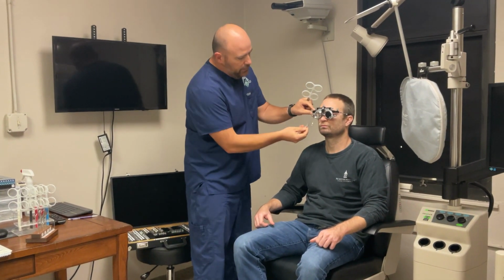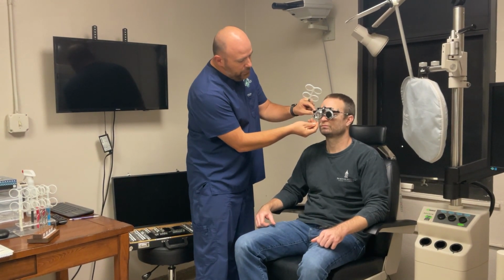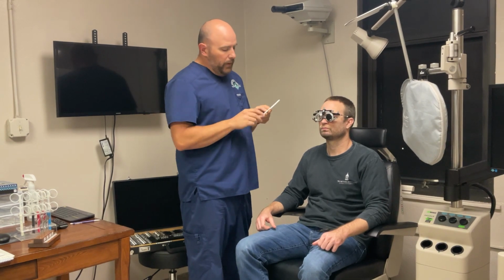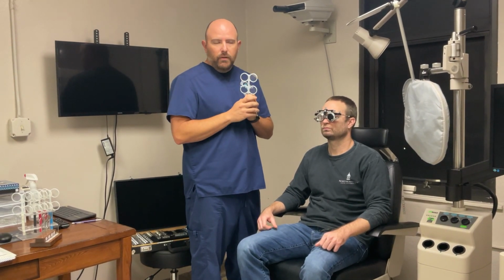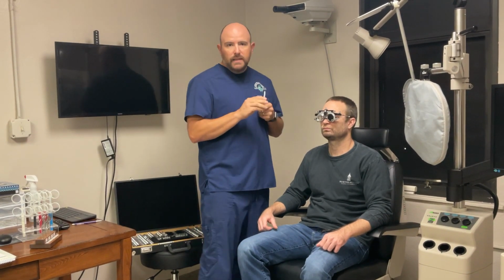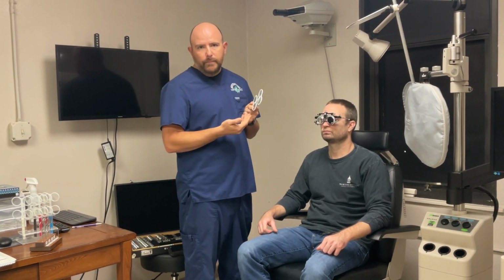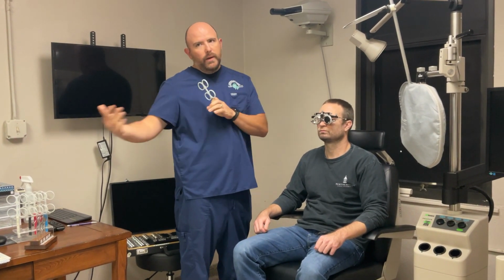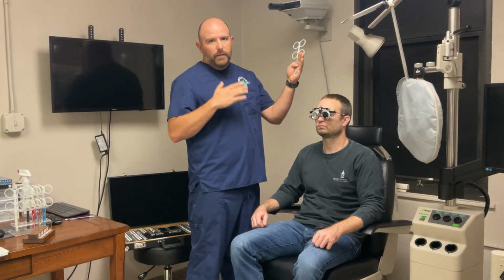Let me put this in place here. Again, paying special attention to holding the frame, making sure that the patient is comfortable. So now I've still got the plus or minus half flippers, and I'm going to show him, if I show him a minus a half, I'm showing him minus 5.50. If I show him plus a half, I'm showing him minus 4.50. Because remember, we already bracketed. I was showing him 3.50 versus 4.50, and he wanted the 4.50. Now we're going to show him 5.50 versus 4.50, and we're going to see where he takes us.